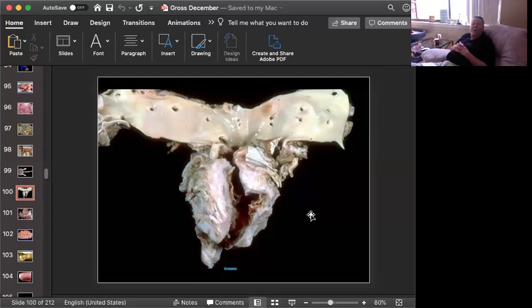And the proliferation covers the proliferation of fibrous connective tissue, fibroblasts, smooth muscle, and all of the inflammatory cells outside of the granulomatous inflammation. So, one more time, this is a proliferative and granulomatous craniomesenteric arteritis with pseudoaneurysm formation.